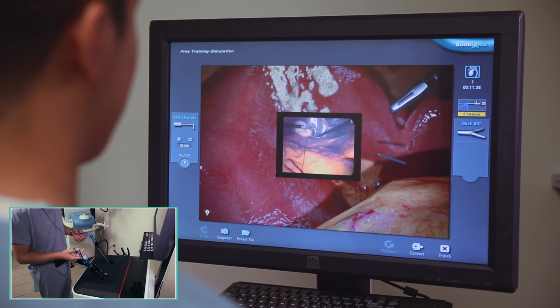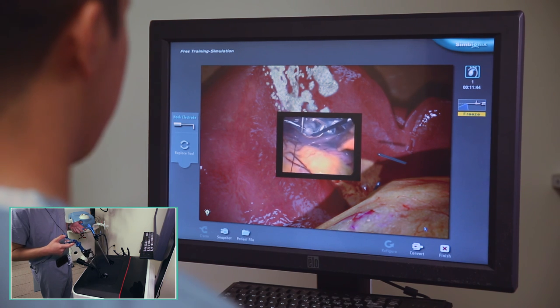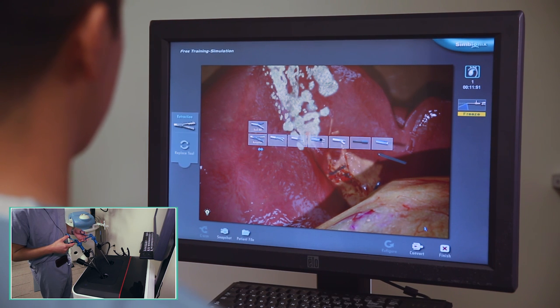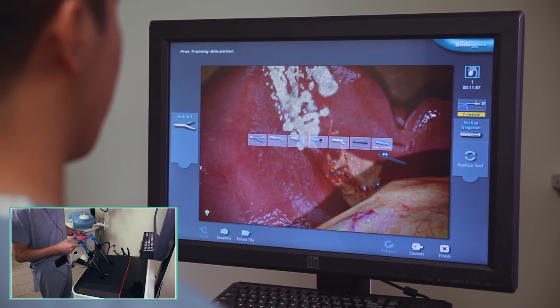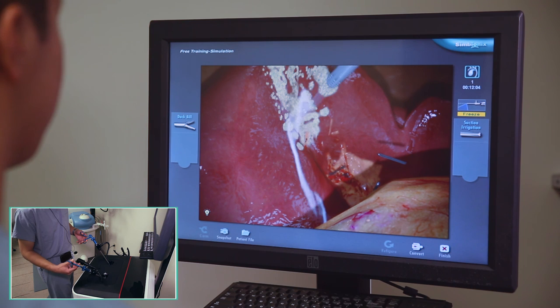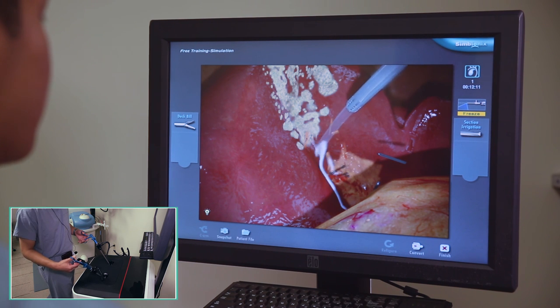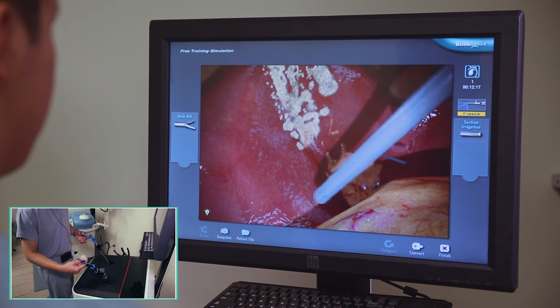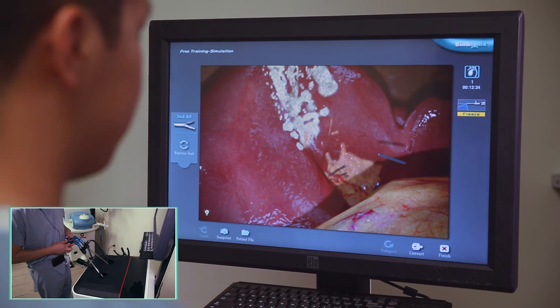That'll play a little video of you successfully, in one try, taking the gallbladder out of the patient in an endo bag. At this point you could be finished, but for technicality's sake, what you'd want to do in a real patient is inspect the surface of the liver — inspect the bed to look for any bleeding, irrigate, and make sure that everything's clean. I'm going to irrigate the surface of the liver and check for any streams of blood oozing down, which would be venous bleeders that I would cauterize. I don't see anything at this point. You'd also want to suction. I can now say that I've achieved hemostasis. We're going to withdraw the instruments from the patient, close skin, and finish the case.